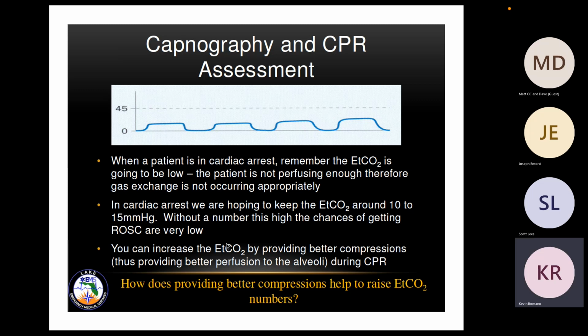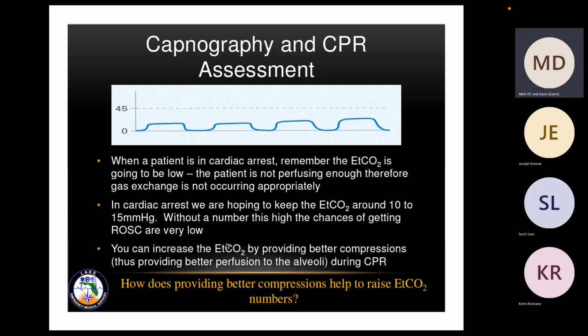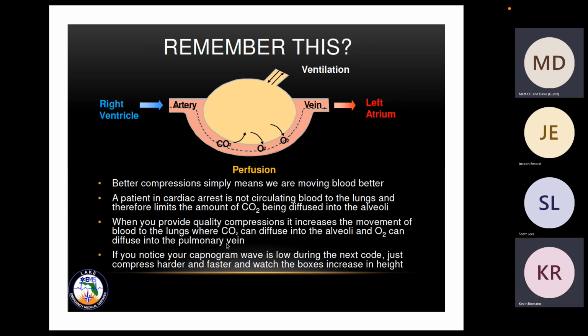So how would you think that would help? You improve your chest compressions, make sure that you are releasing all the pressure so you get a full negative pressure gradient in the chest wall, and then you want to watch out for the ventilations, making sure they're not hyperventilating with too much oxygen or too long a period of positive pressure. So watching the respirations versus compression ratio to maximize that properly can give us better results.